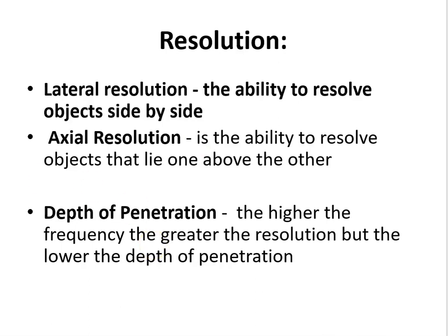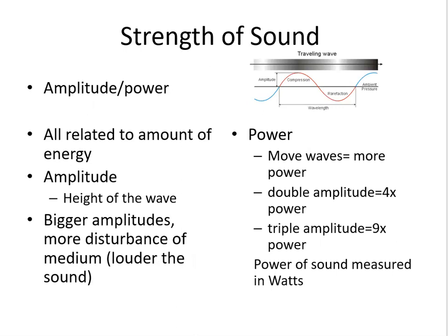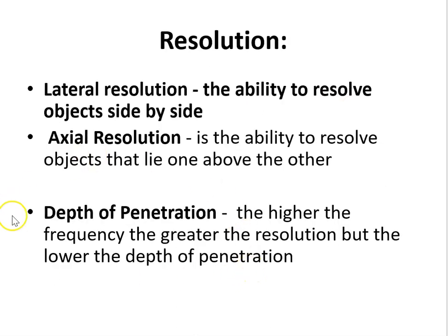And also related to this, and related to the previous slide on strength of sound and power, we've got to consider the depth of penetration. If we're dealing with something very superficial, then a low amount of power may be able to get enough sound waves to hit that structure and bounce back. Whereas if you're dealing with something very deep within tissues, you're going to have to increase the number of watts of energy that are used, so either more sound waves or a greater amplitude, and that will result in a larger echo, which you can then detect at the detector.